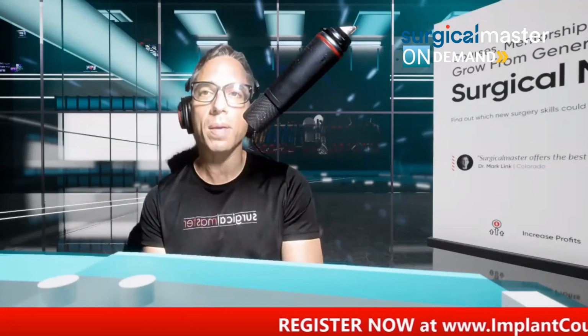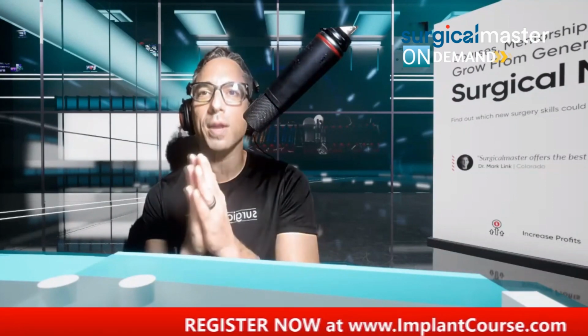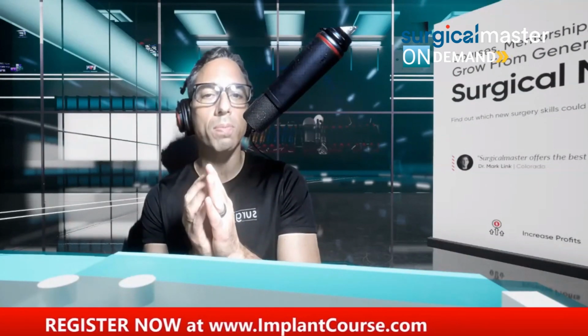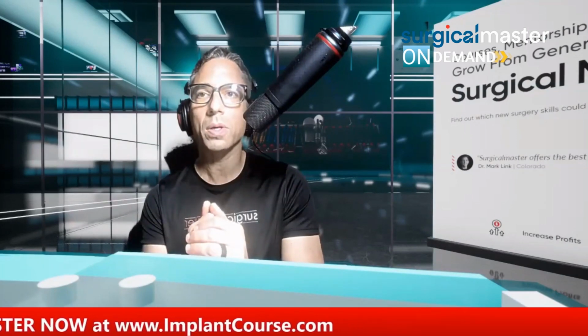So don't get hung up on how. There's different ways to get to Rome. By even learning the basics of implants, you create an osteotomy by changing the diameter of drills. So you start with a narrow diameter drill, then you go to a medium-sized drill, then you go to a large or wide drill.